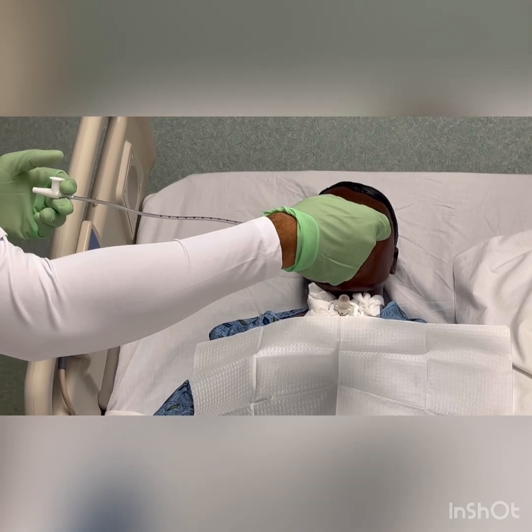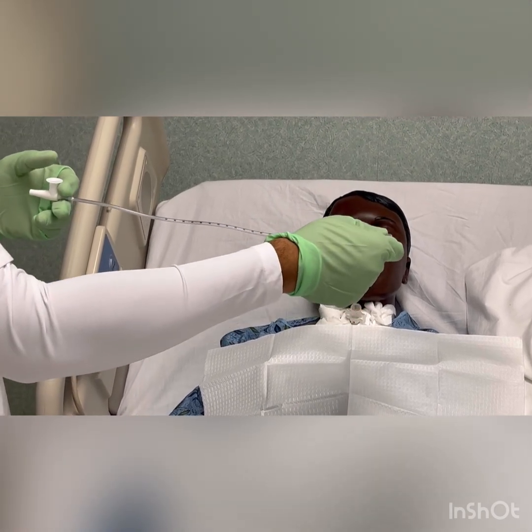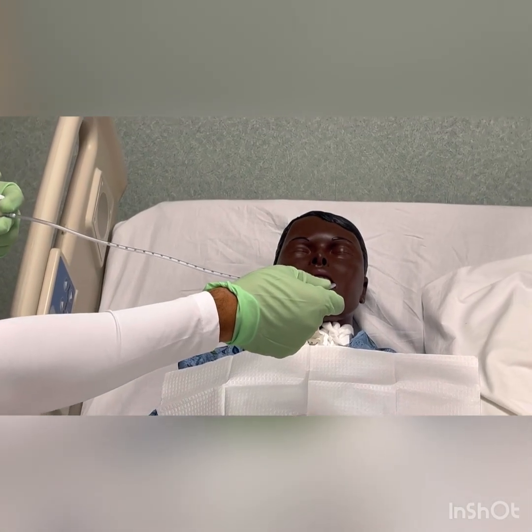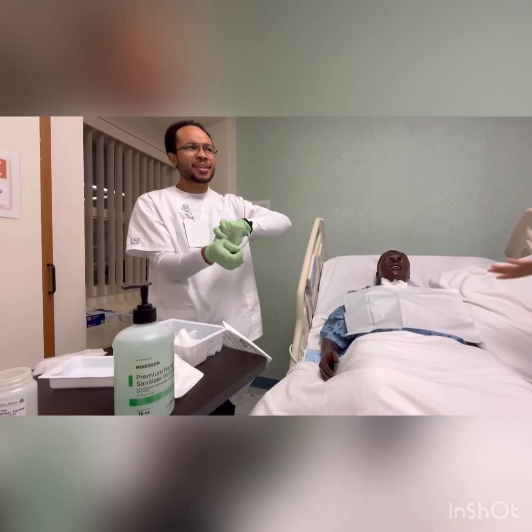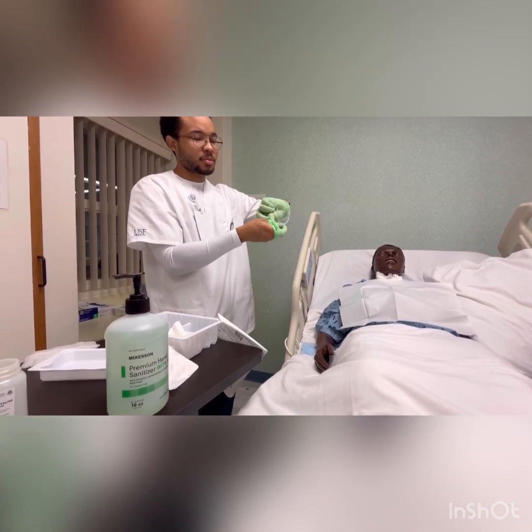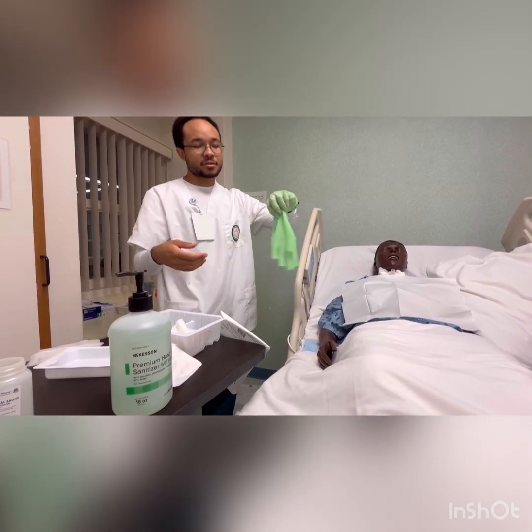Make sure to hyperoxygenate the patient between each pass, and then limit the total suctioning time to around 5 minutes. Coil the suction catheter in the dominant hand, wrapping it around the dominant hand, and then pull the sterile glove off over the coiled catheter.